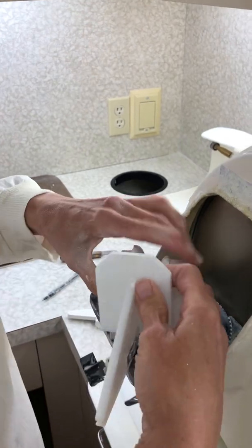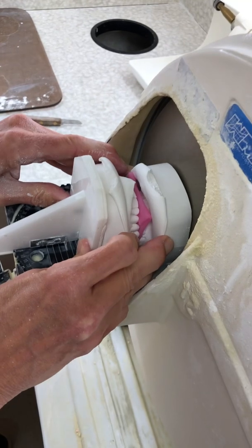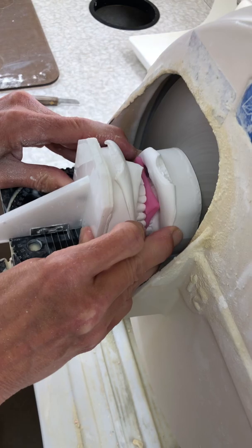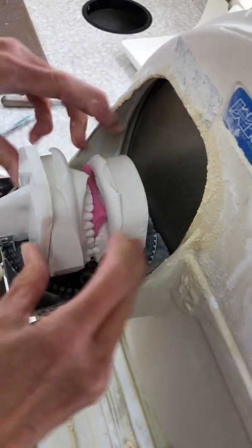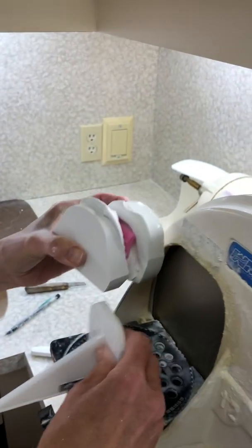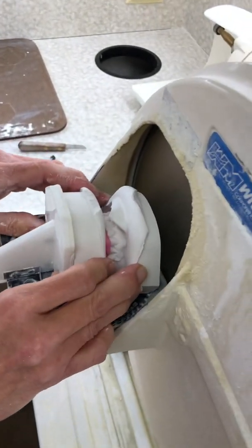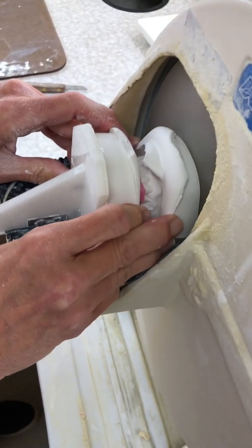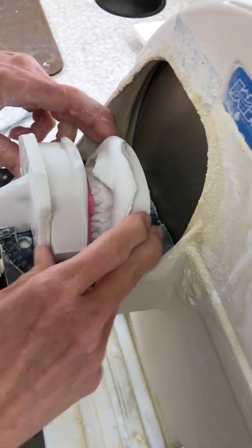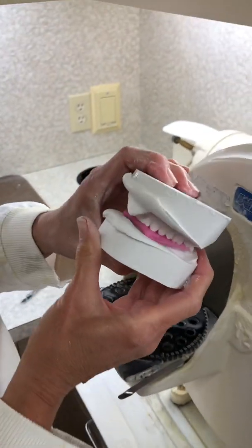I'm going to flip it around once more, and I should be able to finish off the front here, or the bottom. Okay, I've probably got about 2 millimeters left. So you take one more look at it. I think I might take off a little bit more on the top, and this is all basically by looking at it with your eye. Okay, we're at 70 now, so that's good. So there's our model at basically the first stage of things.